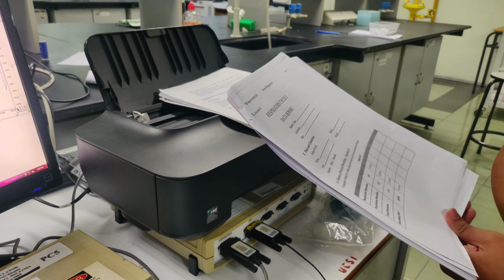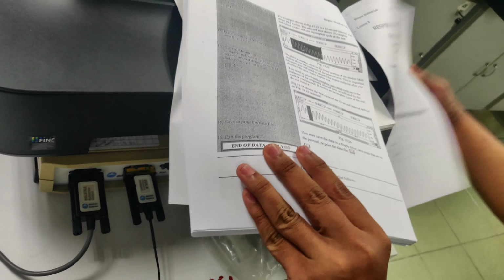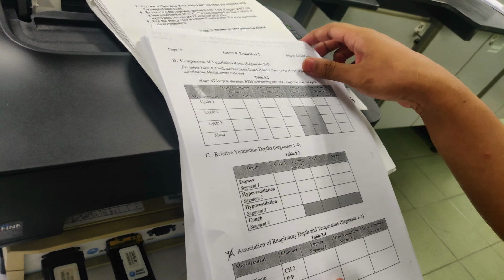For the analyzing part, you can refer to your manual. Actually, we have lesson number 8, respiratory number 1. So you have a few tables. We have table A for the normal breathing, and then we have table B for the comparison part.